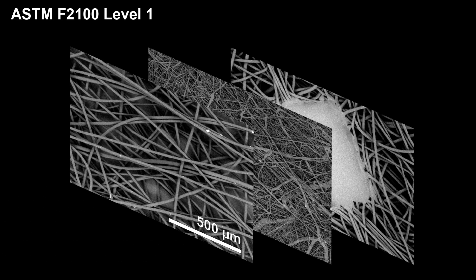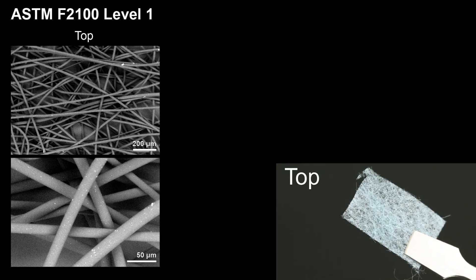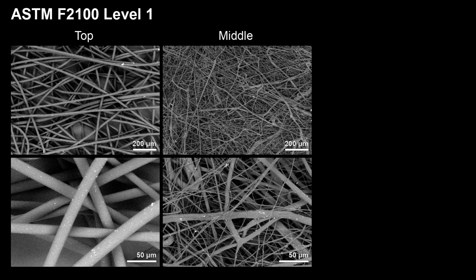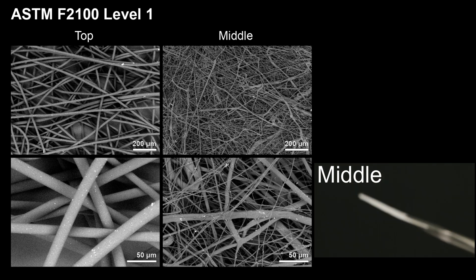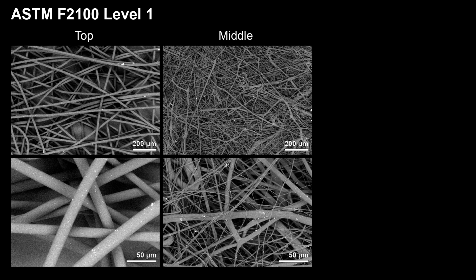Let's look at the level 1 mask in detail. It is composed of three layers, starting with the top layer. The image shown on the top is a low magnification image, while the image shown on the bottom is a high magnification image. The top layer is actually quite thin and you can see through it with your naked eye — the fiber diameter here is about 18 microns. The middle layer is the important filtration layer. Structurally at the microscale, the fiber density is much higher, and the average fiber diameter is much thinner than the top layer, at about 1.8 microns.